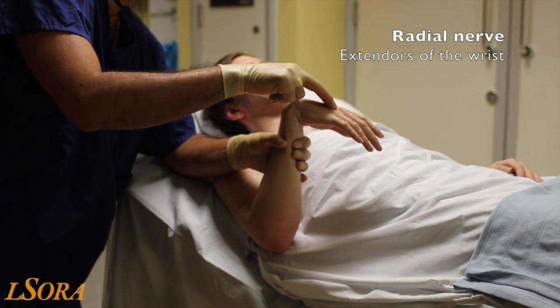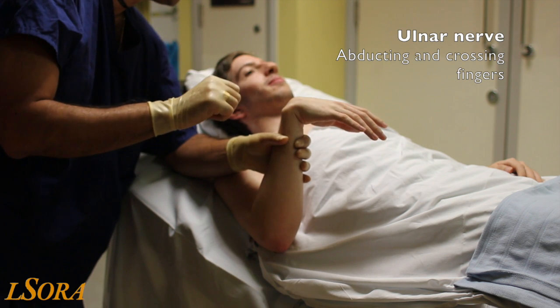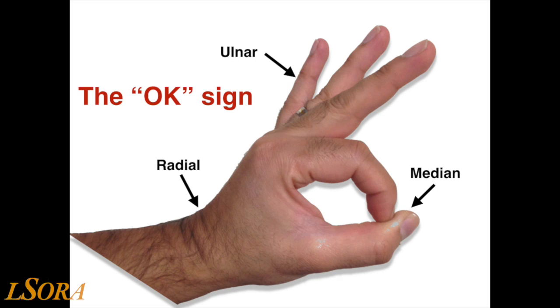The radial nerve is tested distally by looking at wrist extension, and the ulnar nerve by abducting or crossing the fingers. To test median, ulnar and radial nerves at the same time, ask the patient to perform the OK sign with the wrist extended. Inability to do all components shows that the nerves have been blocked well.